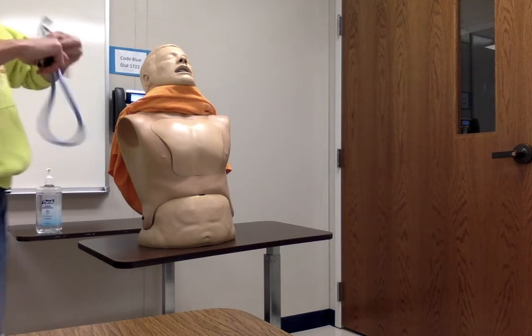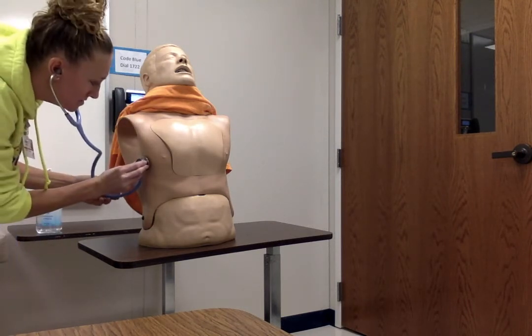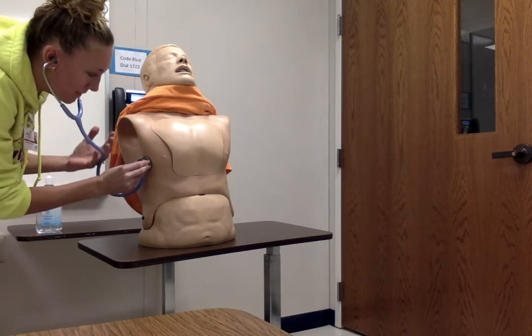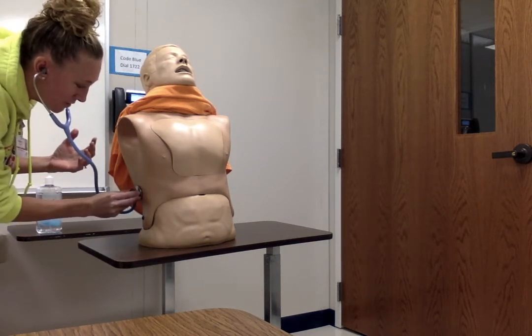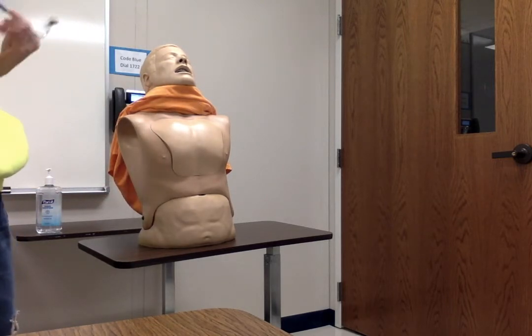You just take your stethoscope here, and this is when you have the patient take a deep breath in and back out. You're going to listen here, here, and then that extra one here. Same thing on the left side, just not the extra one.